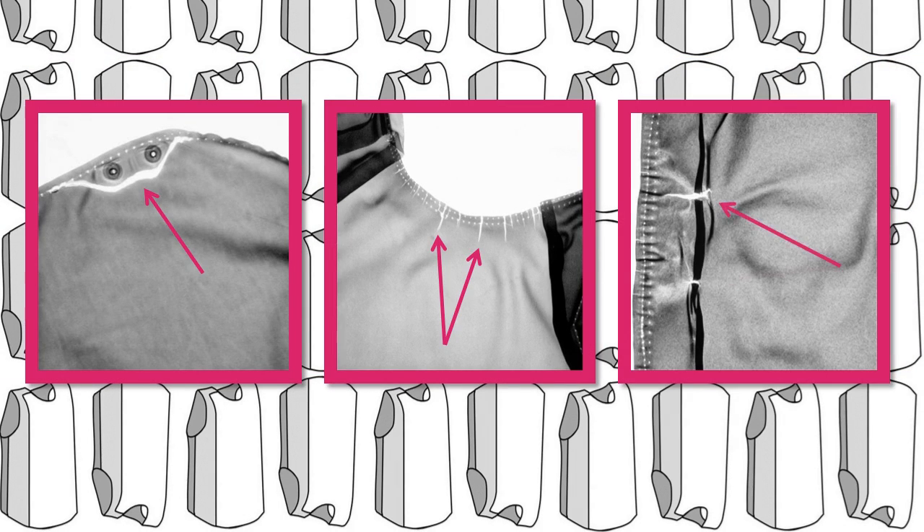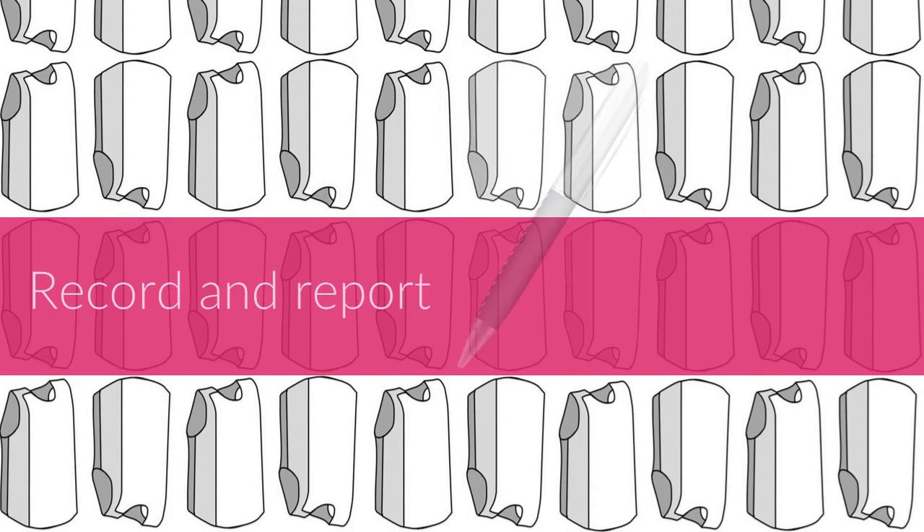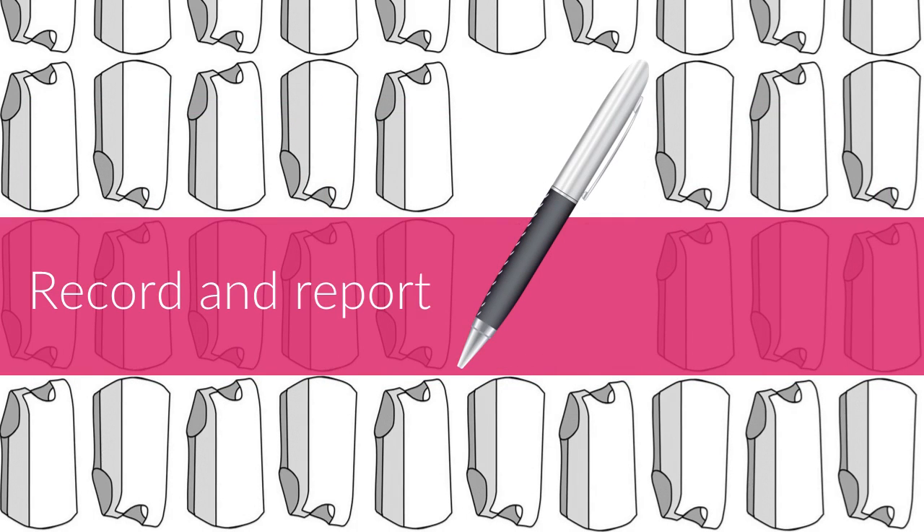If you're not sure about what you should be looking for, ask someone for help. Record and report any damage you find. A decision can then be made if it can still be used with closer monitoring for further damage, or removed from circulation.